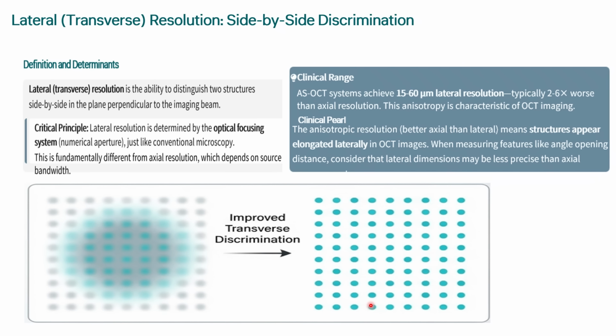So exactly it is the same, the lateral or the transverse resolution. If you have high axial resolution for the lens, you will have limited visual field. That's the lateral resolution for that lens. This is applicable for any optical system like the indirect ophthalmoscope or slit lamp or whatever. But here in the OCT, the idea is completely different.